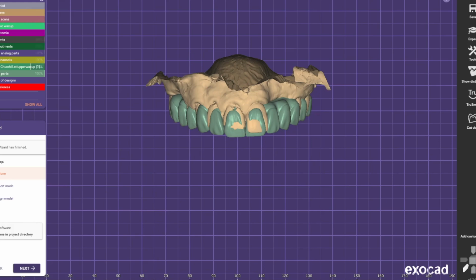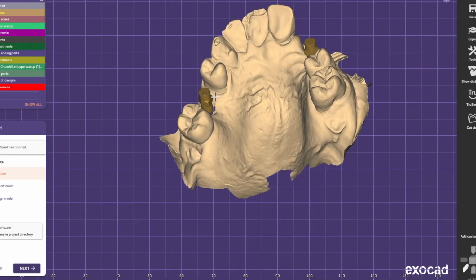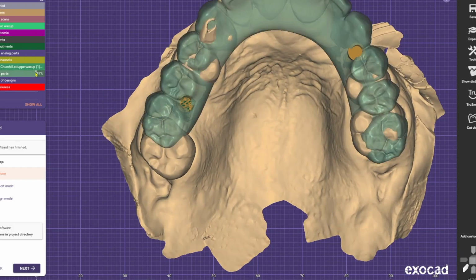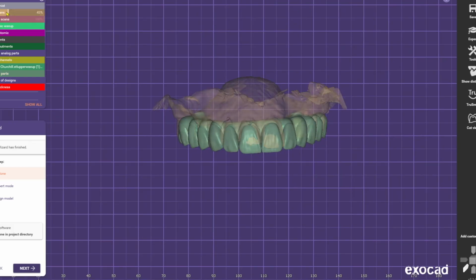So now I had the pre-design, so he gets the parts in, places the MUAs, torques those in, and then he scans those with a multi-unit scan body. And so I take the new scan and I overlay that. Here's my scan abutments right here. He used a DES 52.007 scan body. And now I basically take my hybrid pre-design and I design a restoration, essentially virtually extracting the remaining teeth and creating this flat hybrid, as you can see here, engaging into 2 implants, into 2 multi-units.